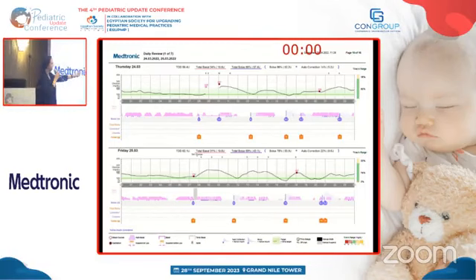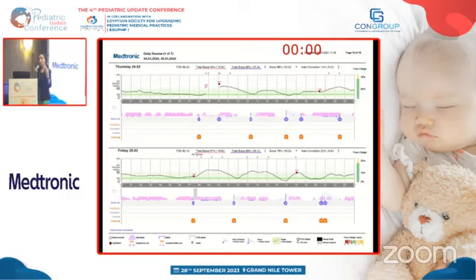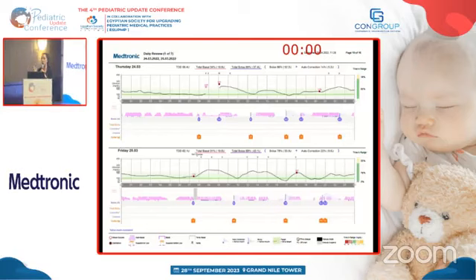كل الدوتس البيربل الموجودة تحت دي معناها كلها اوتو كوركشن، يبقى كل دي دوز كانت مزد من الدوس الأساسية، فالسيستم كان بيعوضها بان هو بيدي اوتو كوركشن عشان يعوض، فبيبقى بعد الوقت بتاع الميل هنلاقيه رجع تاني للنورمال، ده بسبب الاوتو كوركشن. يبقى انا لو كنت اخدت التوتال كله من الاول مظبوط هنلاقي ان احنا السكر بتاعنا كان ماشي فيري ستيبل، ما كانش هيحصل السبايك اللي موجوده في النص عندي.